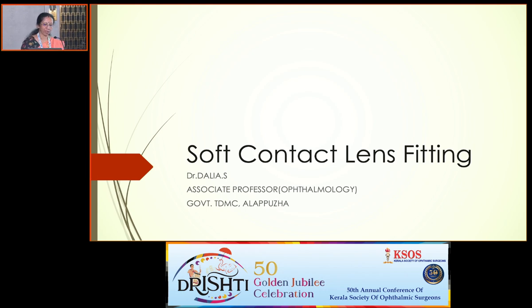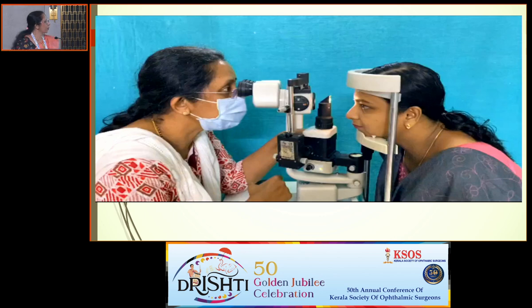So my topic today is soft contact lens fitting. Whenever a patient comes to us for contact lens fitting, we have to look into many factors before we order a contact lens for the patient.